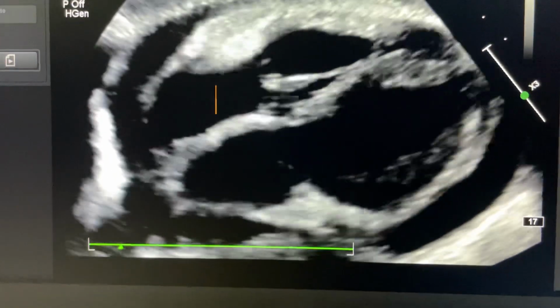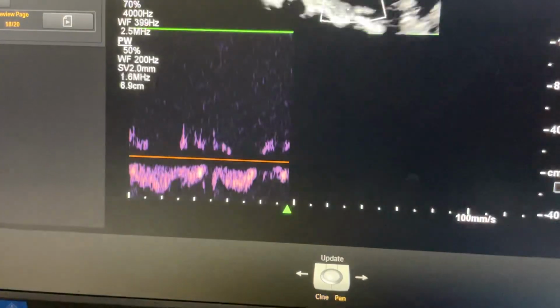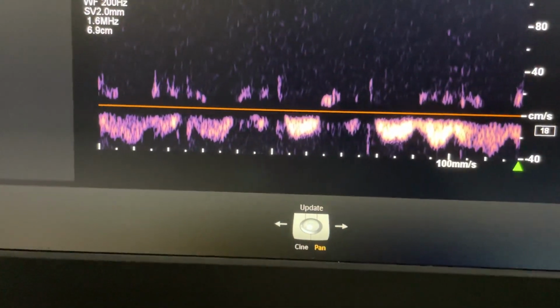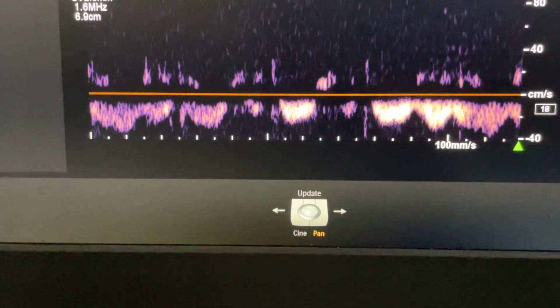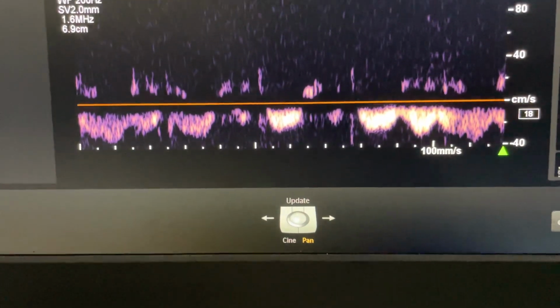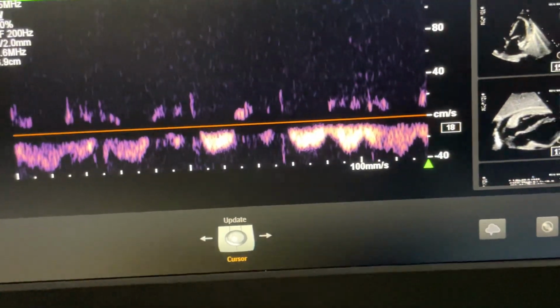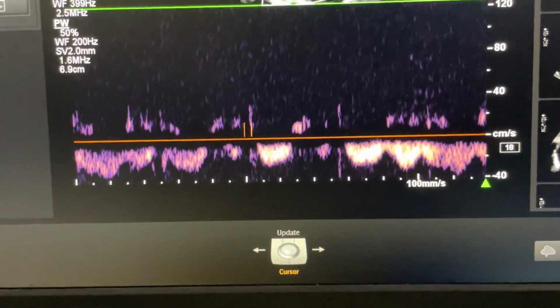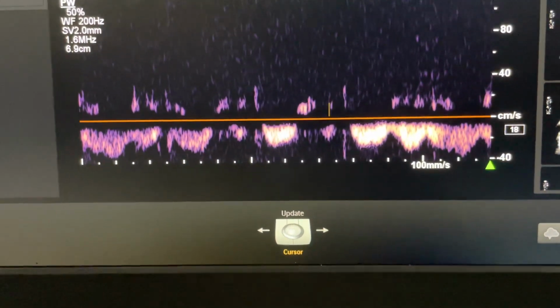So ultimately, the middle hepatic vein has to be seen with expiratory flow reversal. Whenever you see more flow reversal during expiration compared to inspiration, that suggests constrictive pericarditis. So this is middle hepatic vein. Again, this is middle hepatic vein. Cursor is placed in middle hepatic vein. This is the normal flow. The downward flow is normal flow. Upward flow is flow reversal.